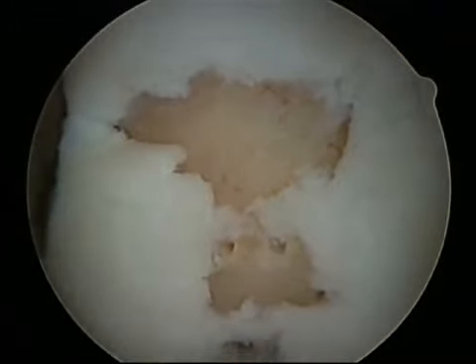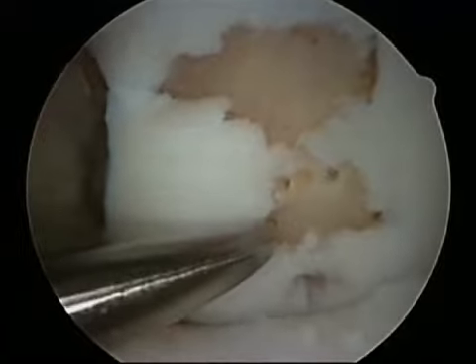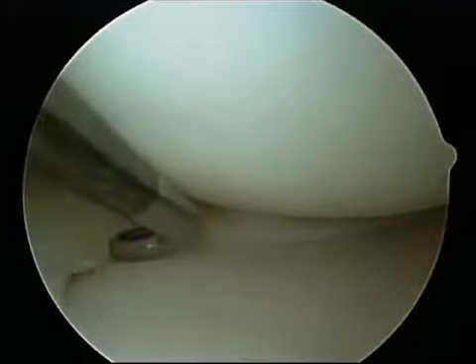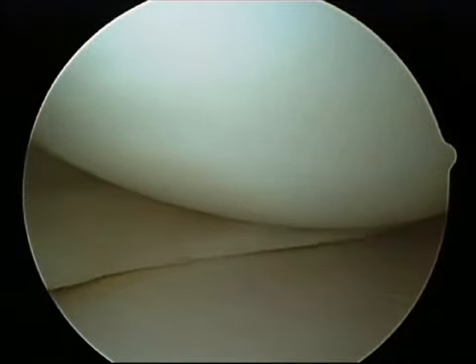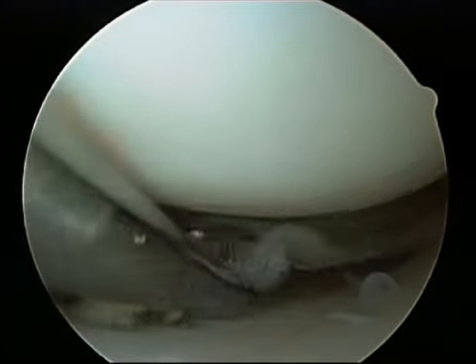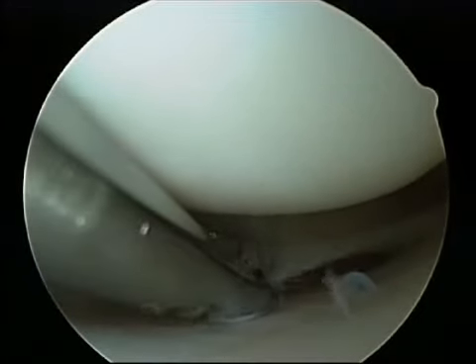Sometimes the surgeon will do a procedure to help stimulate new cartilage to form, but not all patients are candidates for that procedure. The thin curved tissue next to the articular cartilage is the medial meniscus. It is the shock absorber for the knee. Damage or tears of the meniscus can be treated by removing the torn piece or repairing the tear with stitches, depending on the location of the tear.